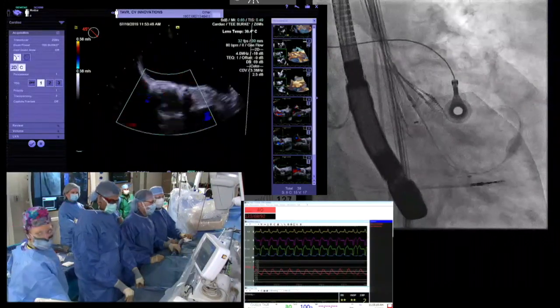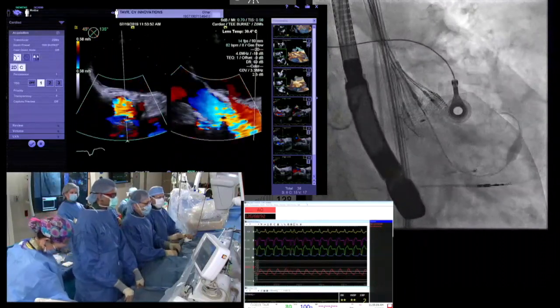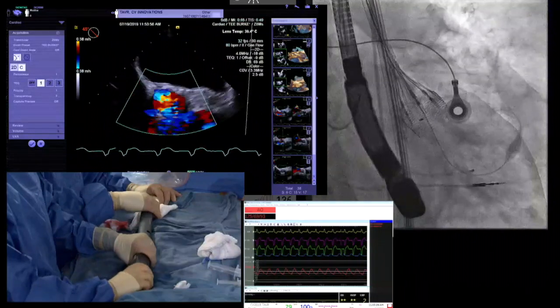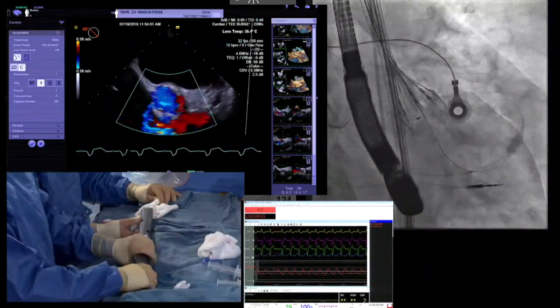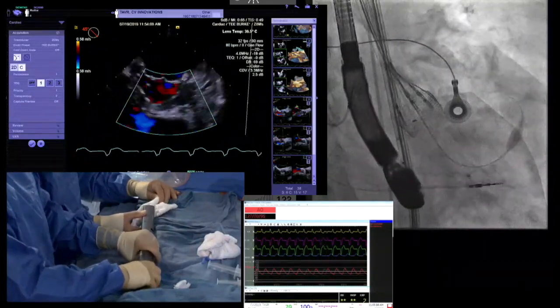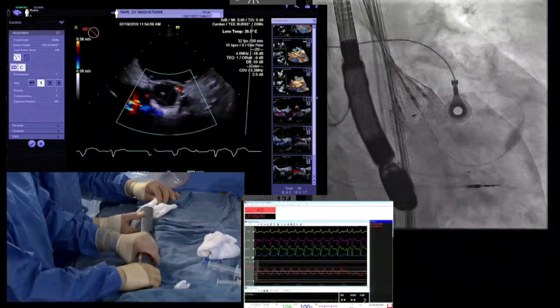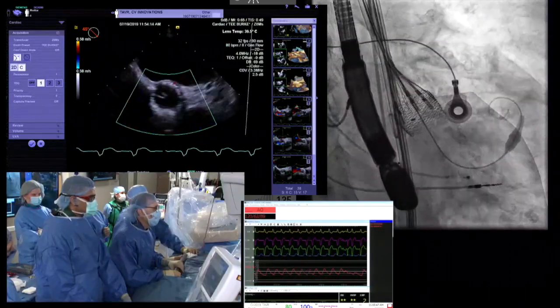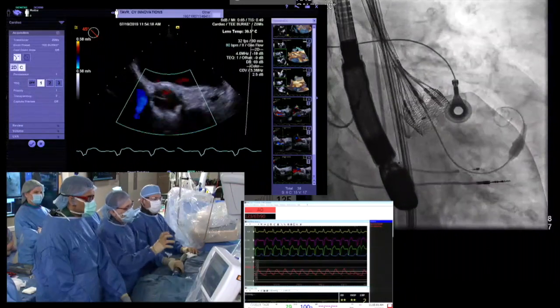I think we maybe even go to the locking before we did that, because while we were talking, we did a little release and come back. And I think we went from 0 to maybe -2. So I think we're not locked on the non. Do you agree? I agree. Okay, so I'm just going to do a little tug test there and see. We're pretty close. Push. And I think we're locked. Bill, you think we're locked? Let's try cine. Okay. So we're locked on all 3. I'm pretty happy with that. Bill, you happy with the way this looks in terms of the locking mechanism?